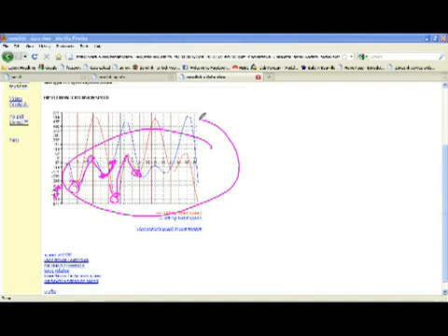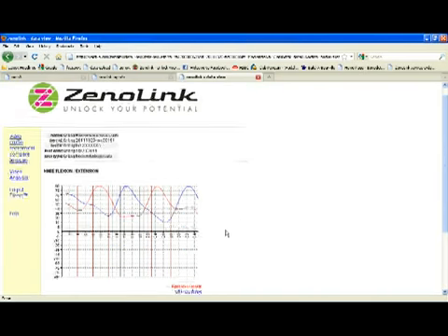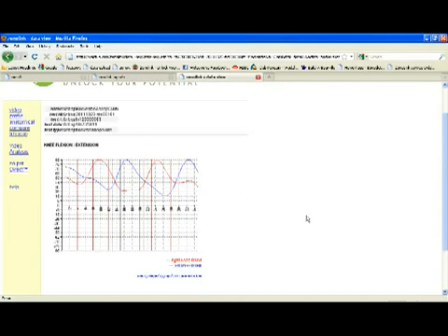So we see push-pull pattern, especially the push at both the knee and the hip, are something that we really want to address in our training. The knee flexion extension range of motion, what we see here is pretty good symmetry in flexion, pretty good range of motion, but probably looking at a little bit of limitation on the right side knee extension.